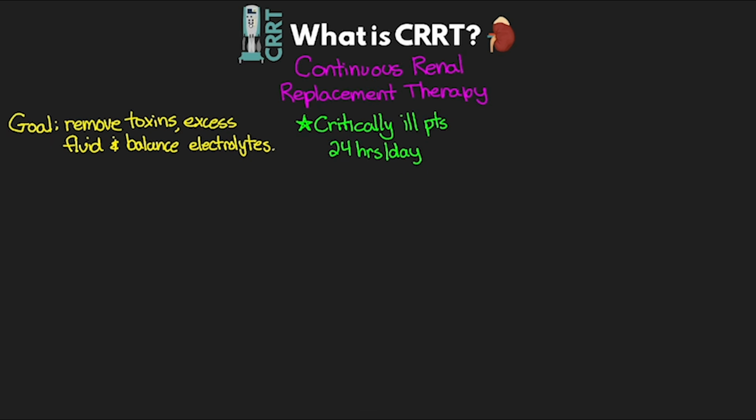Now, it is important to know, though, that not all facilities offer CRRT. Oftentimes in these cases, when we have these critically ill, unstable patients, we're going to offer them a different type of therapy that we call SLED, which stands for Slow, Low-Efficiency Dialysis. These are runs that last anywhere from 6 to 8 hours and are oftentimes done every single day for these patients. So as you can see, that'd be a pretty resource- and time-heavy commitment for these patients, but in facilities where you just don't have a CRRT available to you, this is a really good option for these unstable patients.